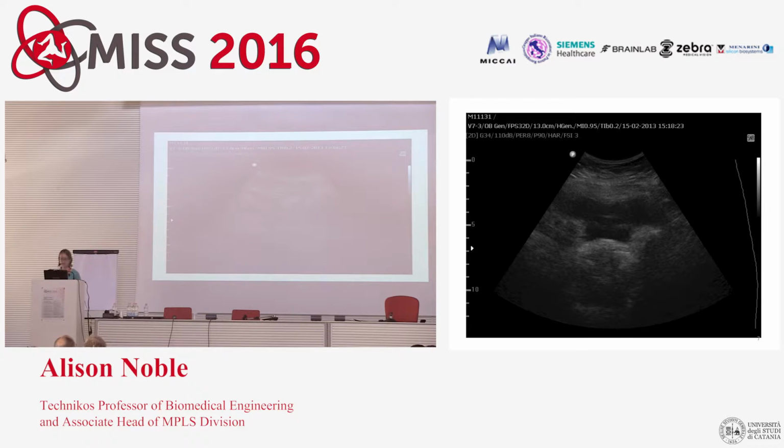I'll run it again, because I will be showing videos, and you'll all be imagining, I've got a great imagination. This is an ultrasound scan, a fetal scan. You might have made out the head, and as you go through, you've got different body parts. That is very typical. This is a very nice scan, I must say, even though you might not.